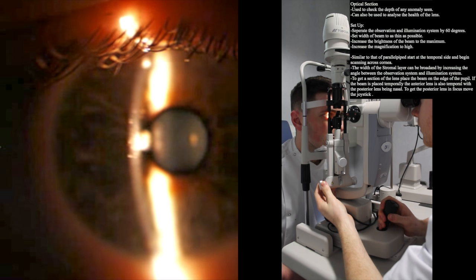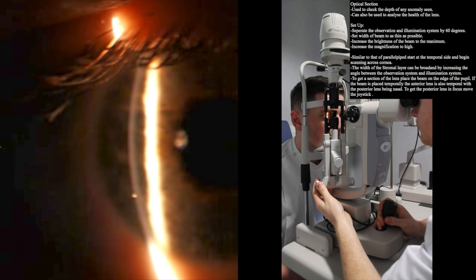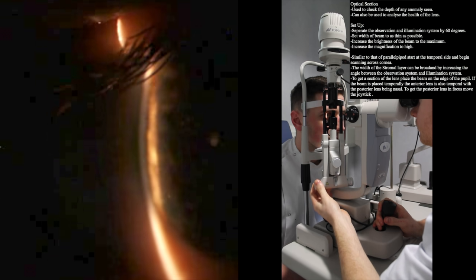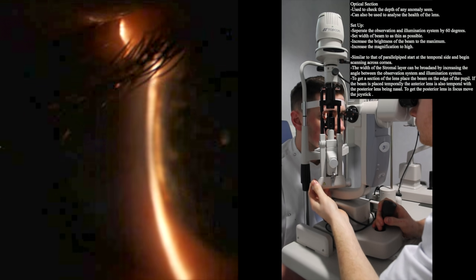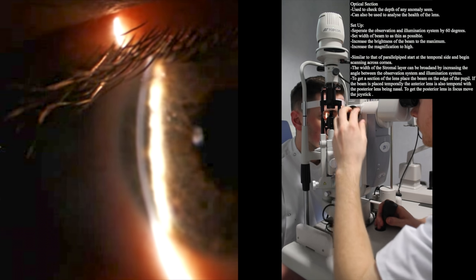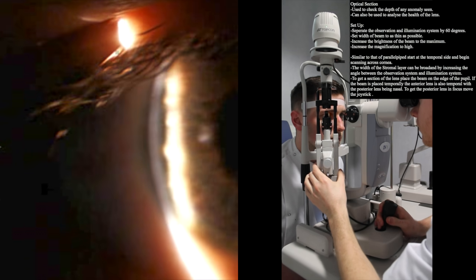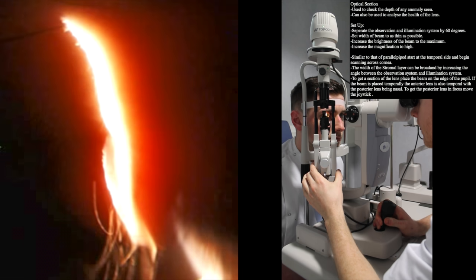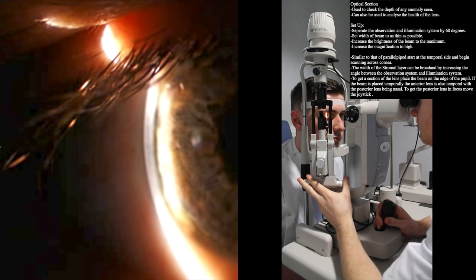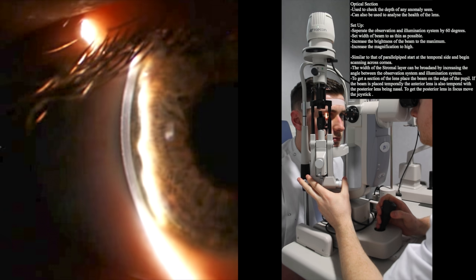To enable us to use an optical section, we want to narrow the beam even further to as thin as possible, increase the brightness to the maximum, and increase the angle between the illumination system and observation system from 45 degrees to 60 degrees. This will help us to improve the resolution of the image seen on the cornea.